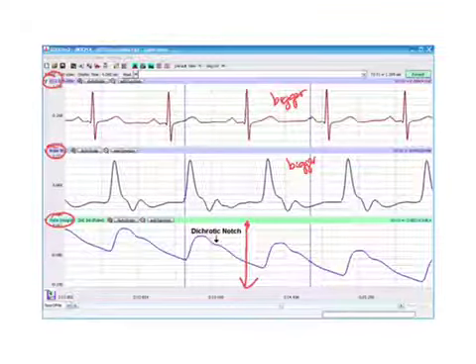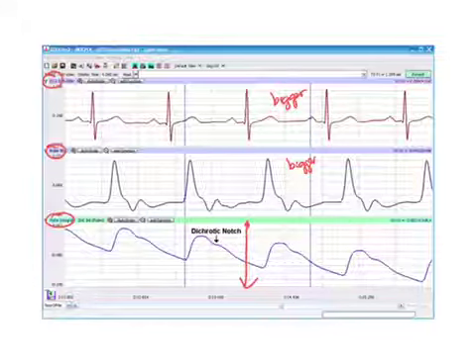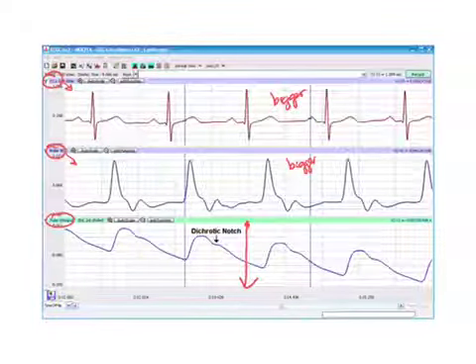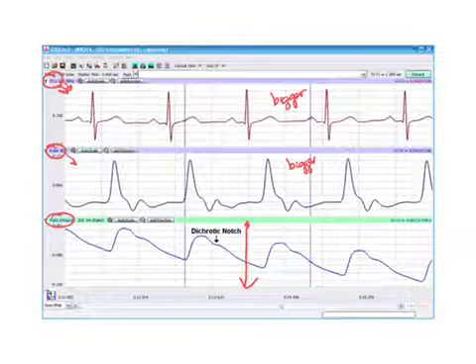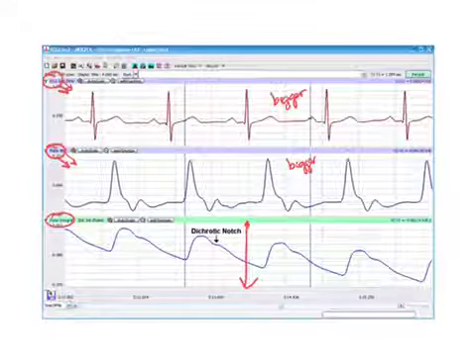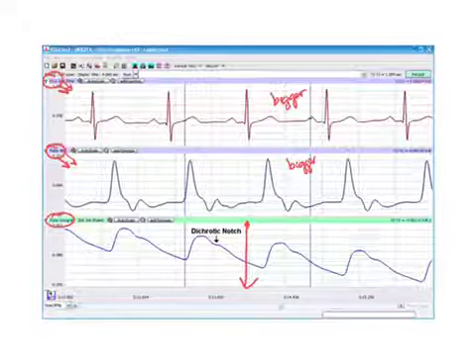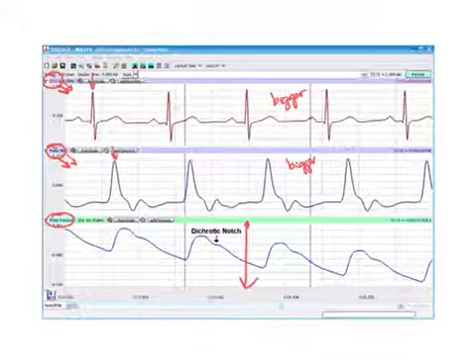So in the lab, you would have been hooked up to the iWorks machine. It would have collected an EKG, and then you would have that pulse plethysmograph on your finger to collect your pulse. What we did in 205 when we were first learning the tutorial. So this represents the electrical events that are occurring, and this is the physical manifestation. The pulse plethysmograph would have been on the finger, while the EKG would have been collected at the wrist. So you can see there's a slight delay from when the electrical event arrives to that physical event of the blood going through.